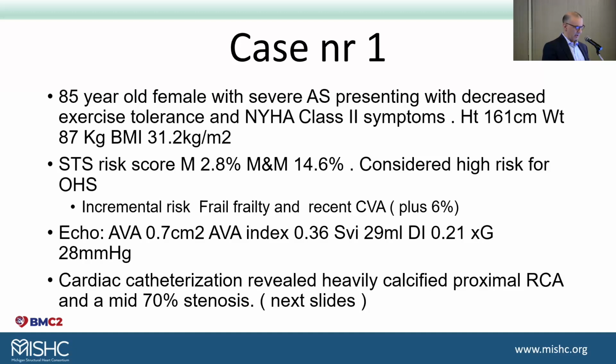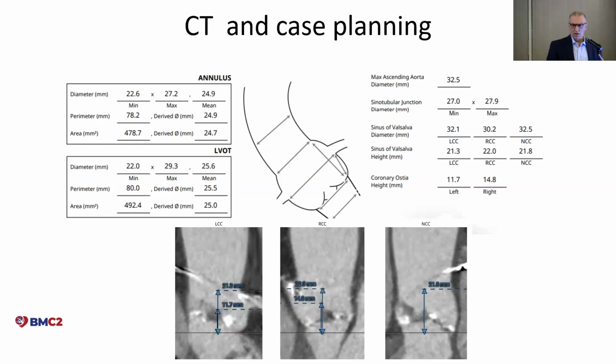So before we go into cardiac catheterization, we believe a CT is critically important. The workup involves a TAVR CT first, because the anatomy of the particular patient, the geometry of the sinuses, and what valve can be put in, if it's even feasible, is critically important. So we don't access the vessels more than once if a decision is made afterwards to fix.